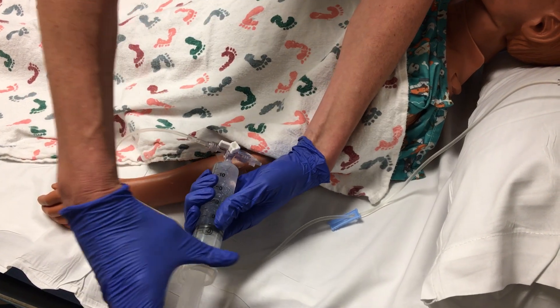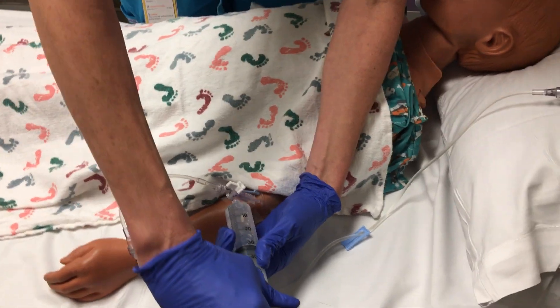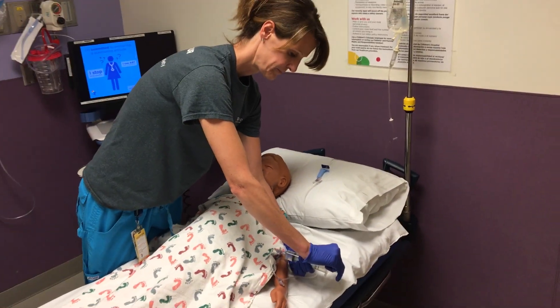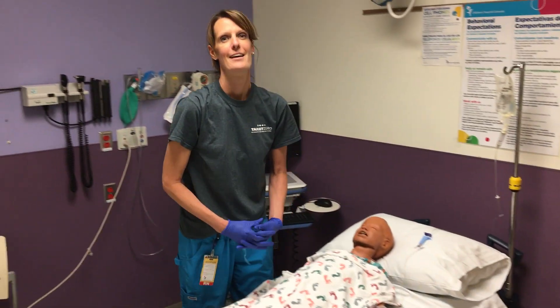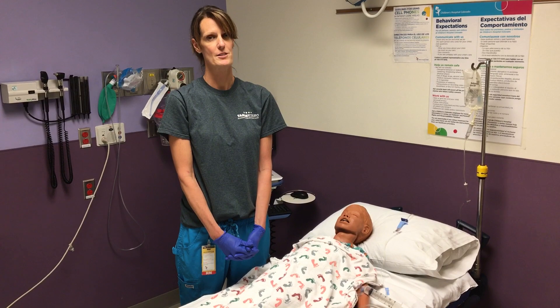Off to your fluid, on to your patient and push. And that's just a nice easy way to get fluids into your pediatric patient very quickly.